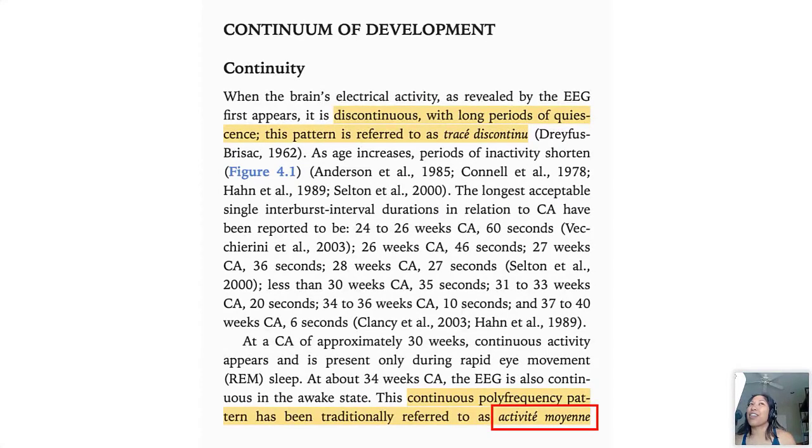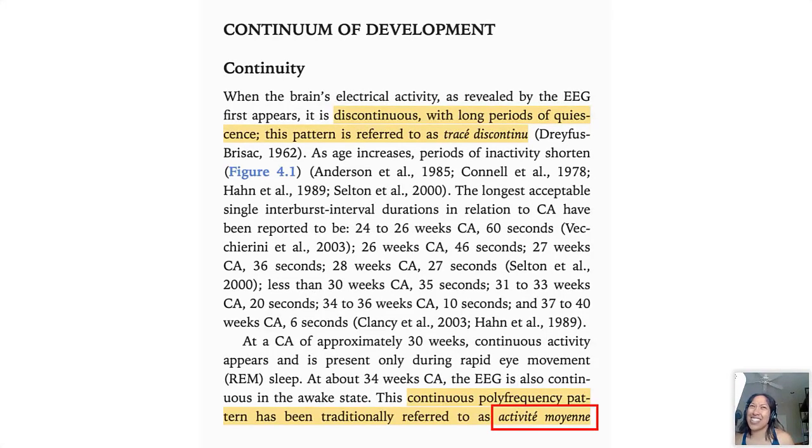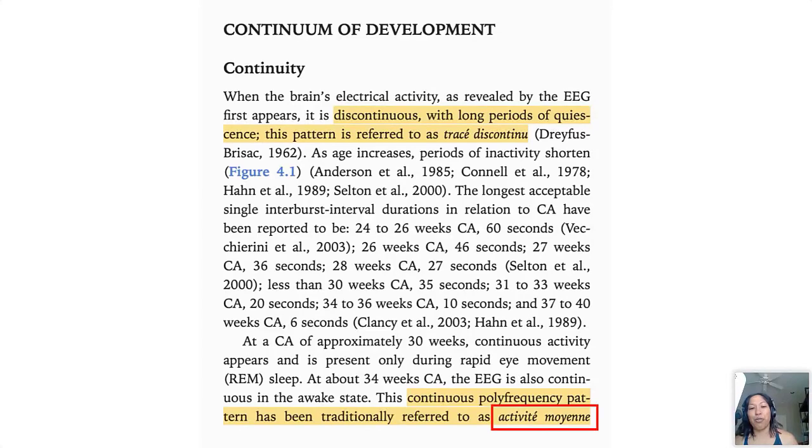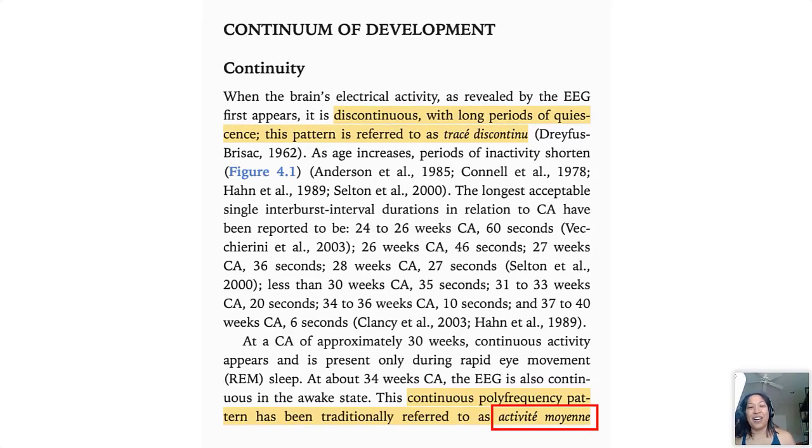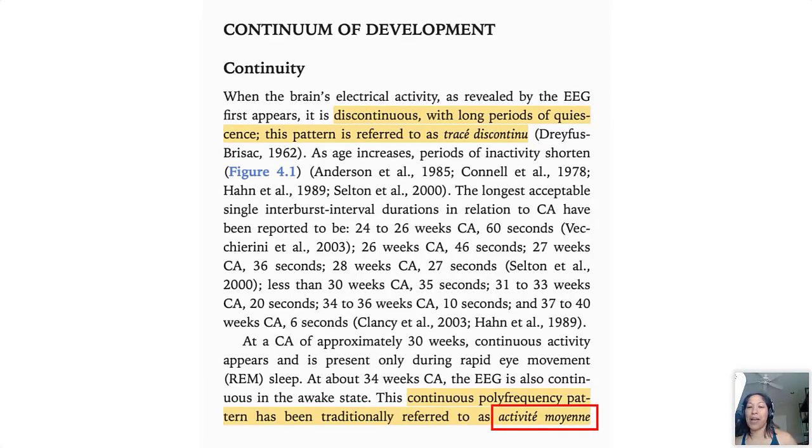Here's, I'm just going to show a few pages of this, but in this example this awake tracing is pretty continuous and I would say fairly symmetric between the two halves of the brain. I just wanted to kind of give a sense of what an awake tracing would look like and to quote the Eli Mizrahi textbook, this combination of frequencies—delta, some delta, some theta, some alpha, all admixed together—is what we call activité moyenne.